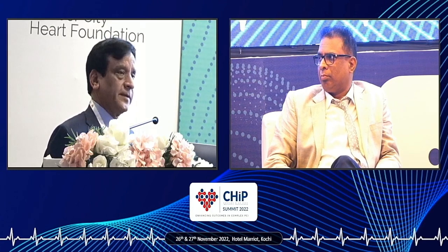So the key is, can you do the remainder in this complex case with the drug-coated balloon? I don't know exactly. Whether the drug-coated balloon will be answerable in those particular types of cases or not, and what the long-term results will be. In a complex case, you have done plaque modification, you have put a stent that is nicely open, but if there is a dissection, you have to put a stent anyway.